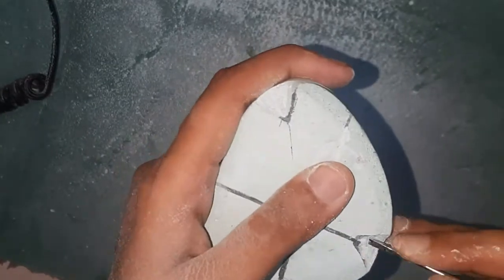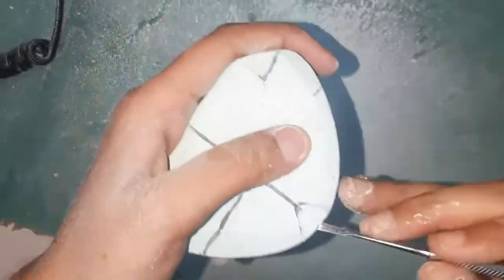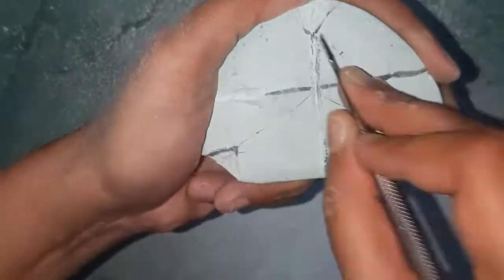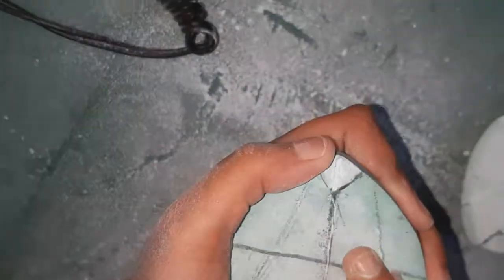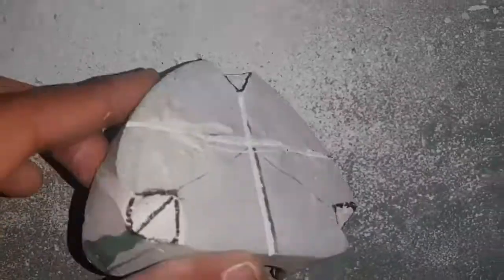Now groove indexing, which is done on the base of the cast. Two lines are drawn, one is a vertical line and one is a horizontal line which are perpendicular to each other.